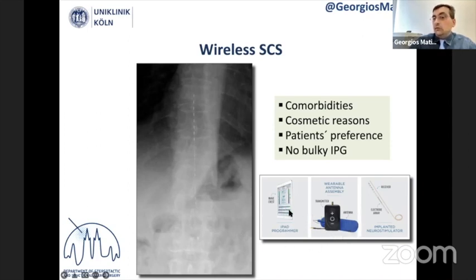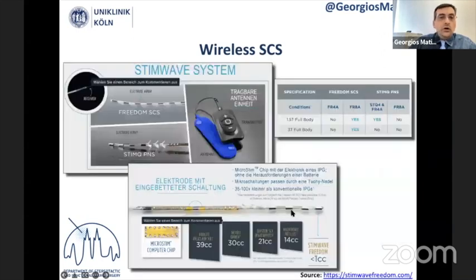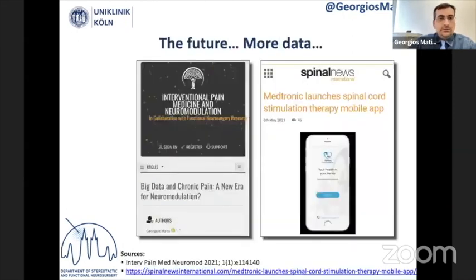Without the antenna, the therapy is not working. This is how the lead looks like. This is once again how the antenna and the transmitter look like. Of course, the main advantage is that the volume of the system is really low, less than 1 cc, when the smallest IPG in the market has a volume of 14 cc's, but there are some limitations.